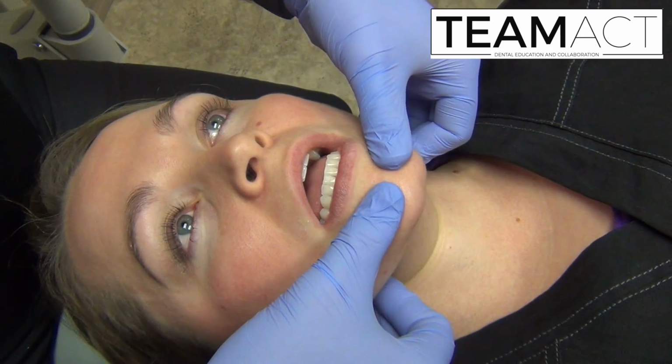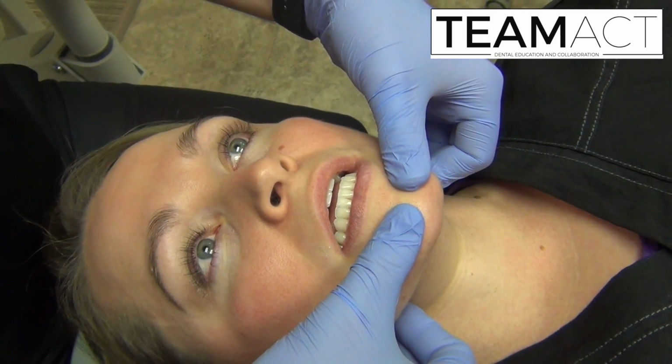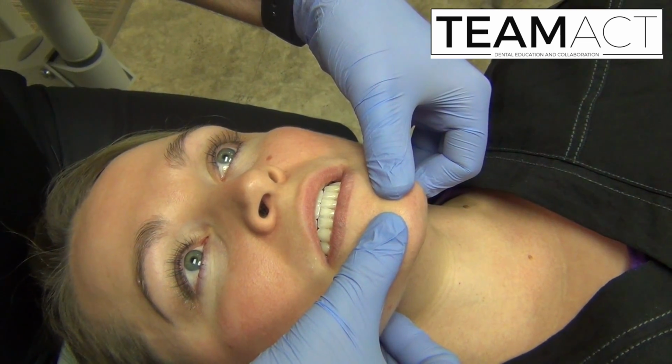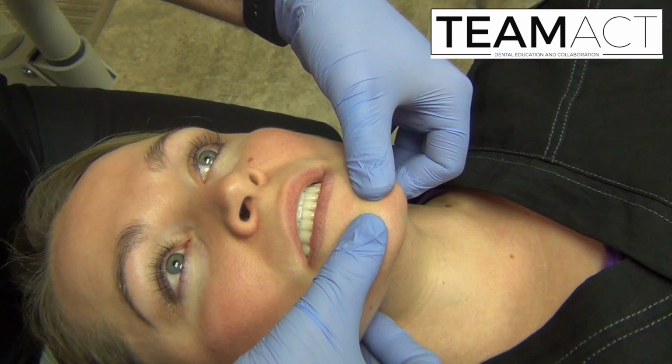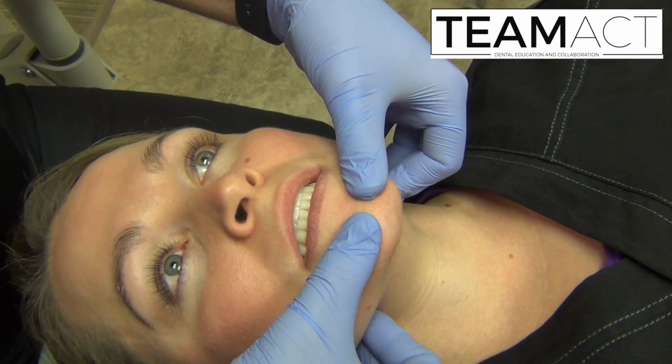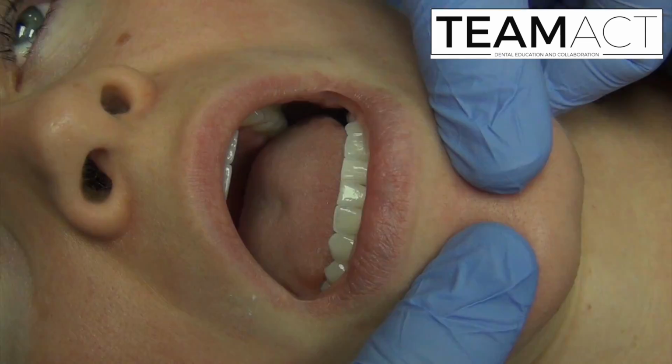Again, demonstrating the technique from a different angle. Proper support is applied to her mandible and she closes slowly until that first tooth contact is identified. You need to record that tooth location once that contact is identified.